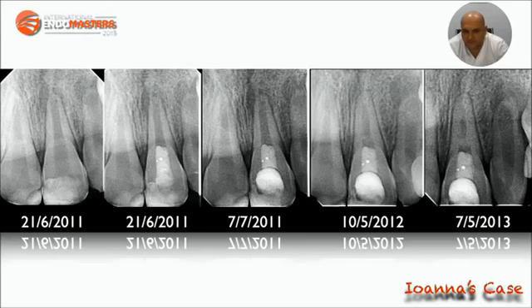This is how we started in the first radiograph. In July of 2011 it was the postoperative radiograph, and 2 years later, although no vitality signs could be detected, it seems like the canal is getting more and more constricted and a dentinal bridging is evident under the MTA. Amazing regenerative potential of the young patient. Dentin wall thickening and dentinal bridging under the MTA.